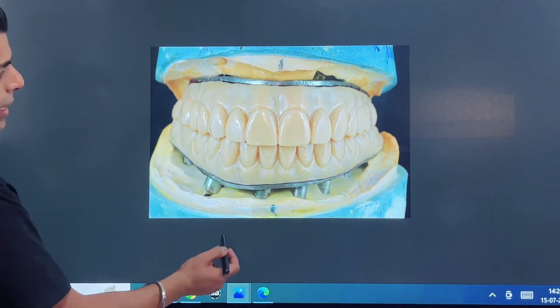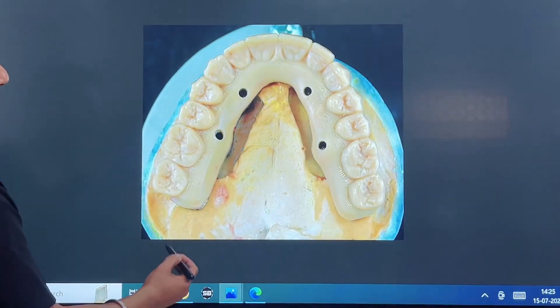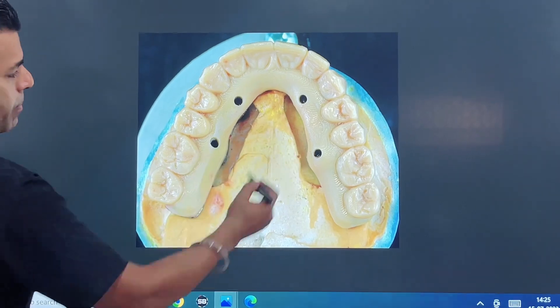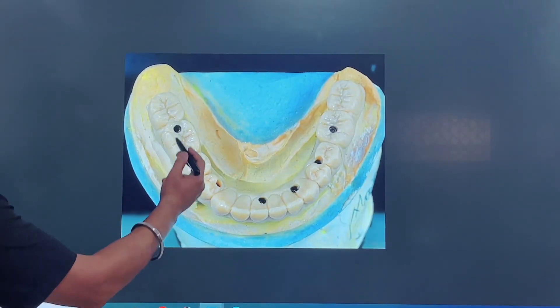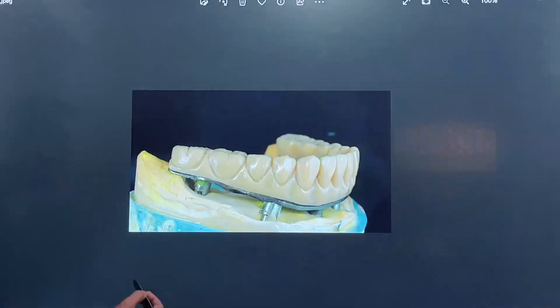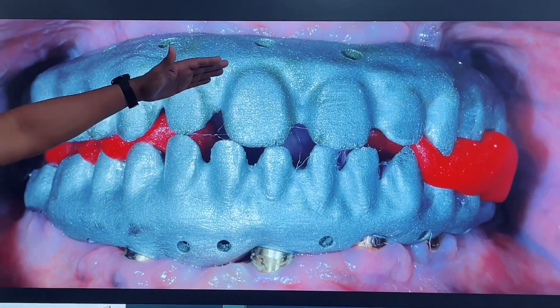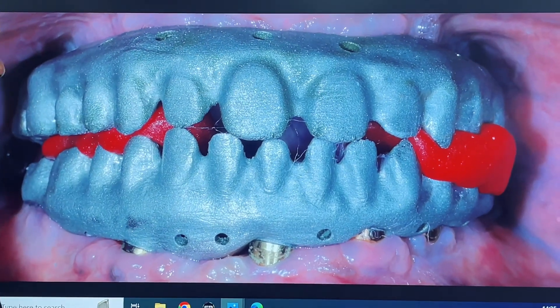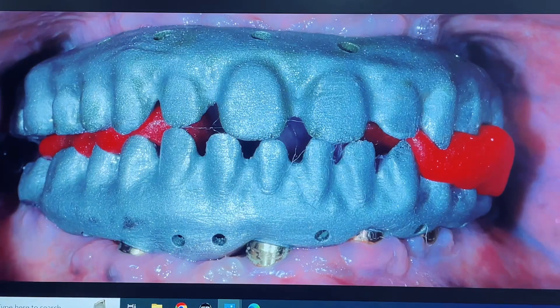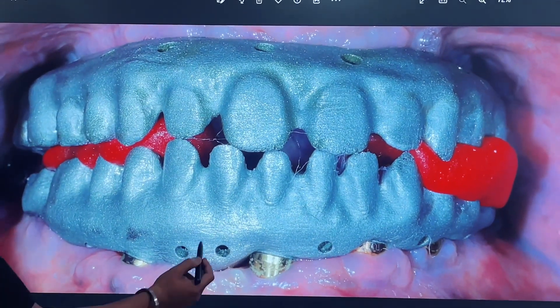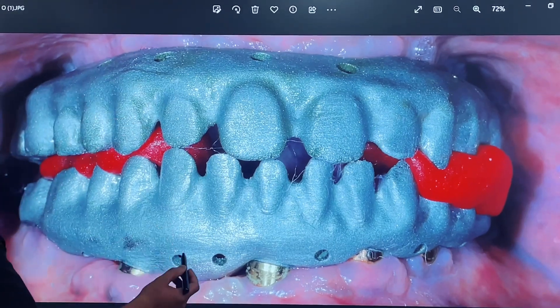Occlusion is very important — prototype trial and tooth occlusion is a very important step. You have to check the midline, shape, and contour. You can see left and right with 4 implants and 6 implants in good placement. Then the framework trial with chromium cobalt and ceramic layering — you don't have to take the bite without checking this pattern. You can also take X-rays to see the passivity of the framework.